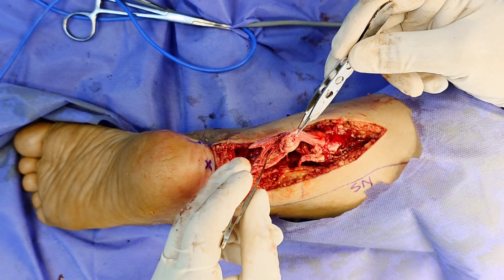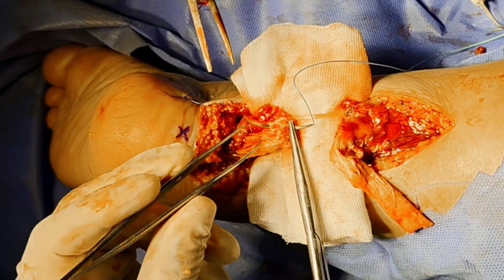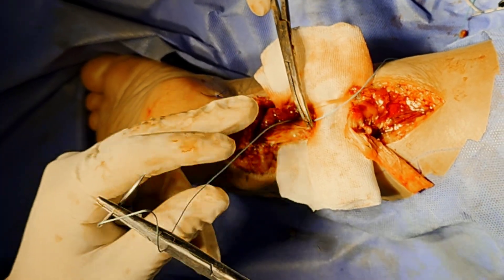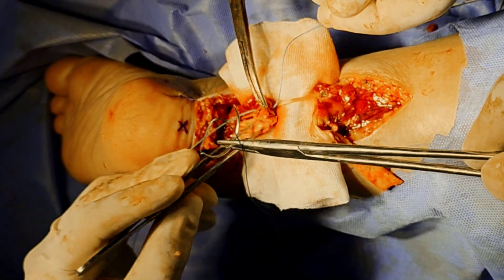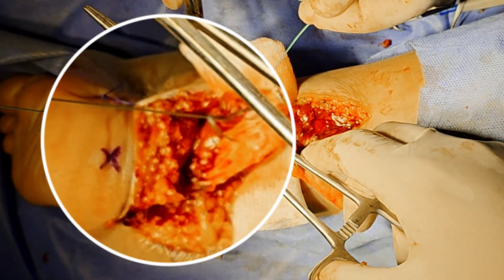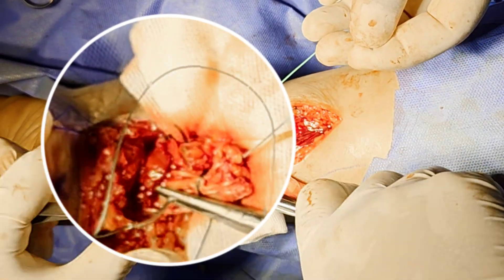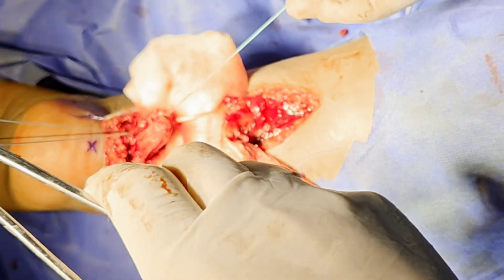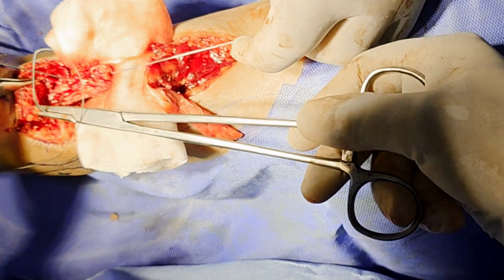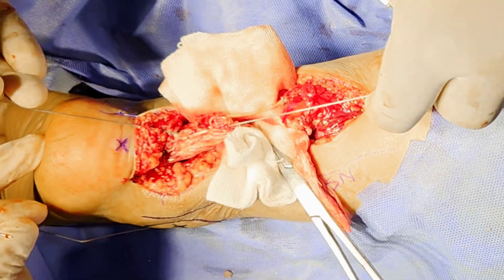After thorough assessment, we are planning to use the modified Krakow technique plus gift box technique for the anastomosis. We start the modified Krakow from the distal stump, taking bites from the core of the tendon — almost 10-15 mm bites, locking every loop. What makes it different from normal Kessler's technique is that we lock loops and tighten after every loop. Failing to tighten will lead to weakness of the anastomosis. We take 2-3 locking loops on each side; here we have taken 3 because the cut is very poor — it has torn the tendon. We ensure our assistant holds the free end of the suture tightly so there is no buckling of the thread.